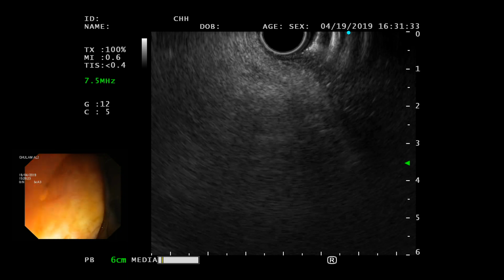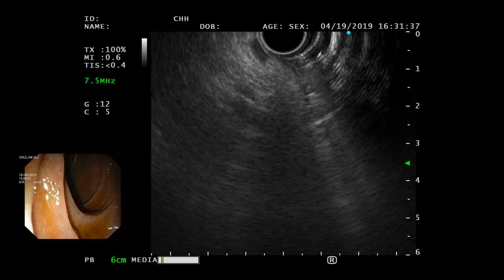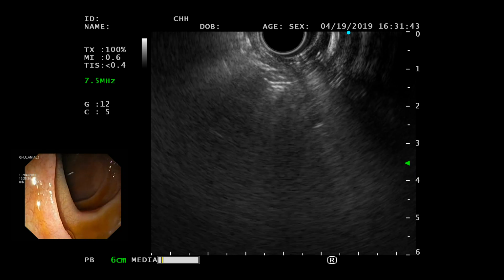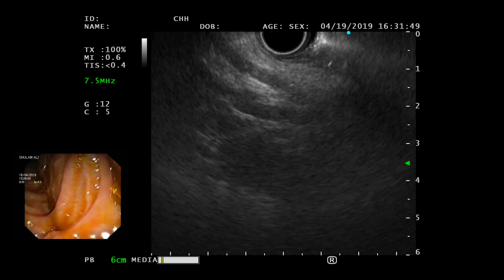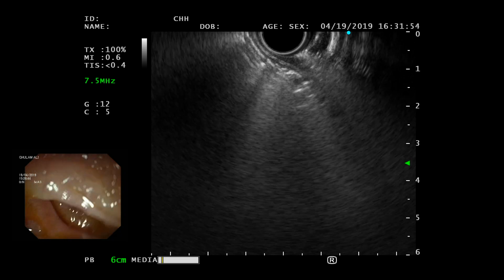I just hooked up, and I'm just pulling my scope back. The whole time I was pulling the scope back. When I hooked it, and I know where to hook it, move the wheel a little bit, and then got into the second part. So staying into the first part is not going to be easy in this one. And let me just take a quick look.